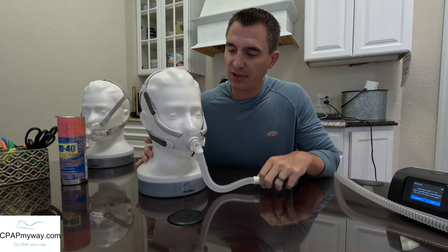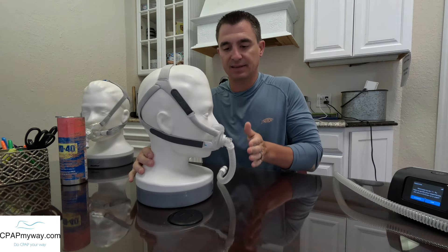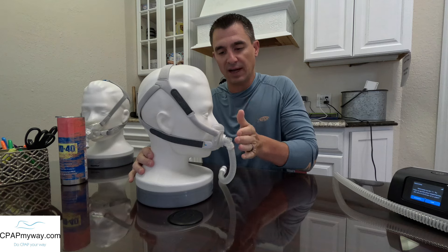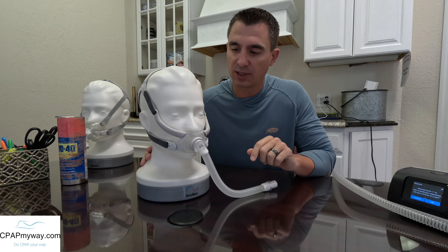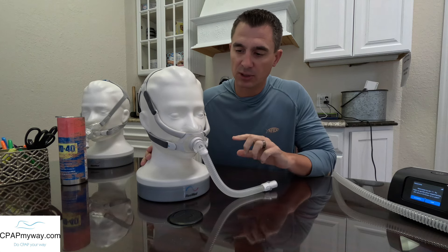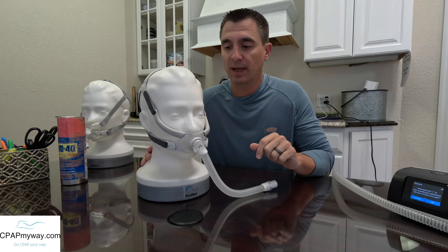Now let's look at the new F40. You can definitely notice right off the bat it's got a much lower profile on the front. This is an obvious change of pace, but there are some other things I really want to impart to you about this mask that you should consider before you make the change.